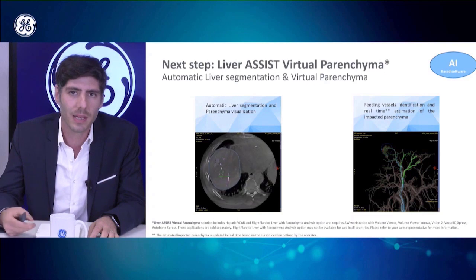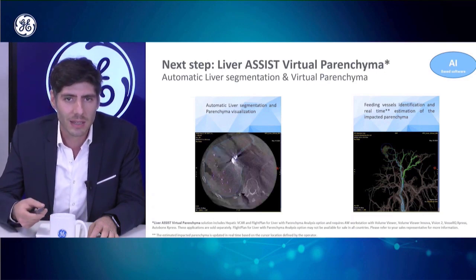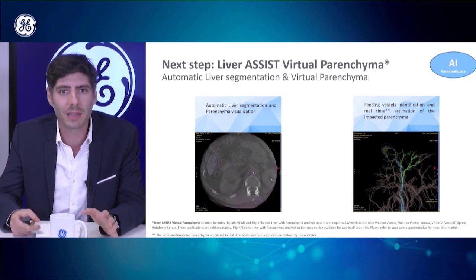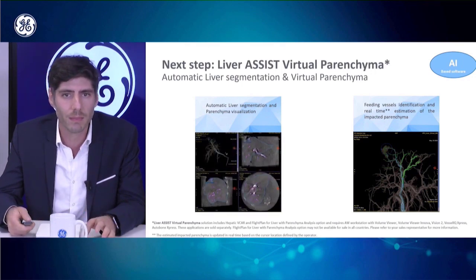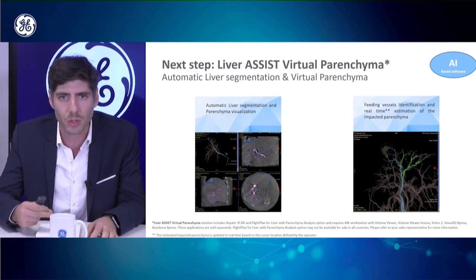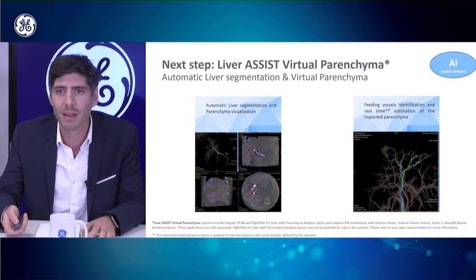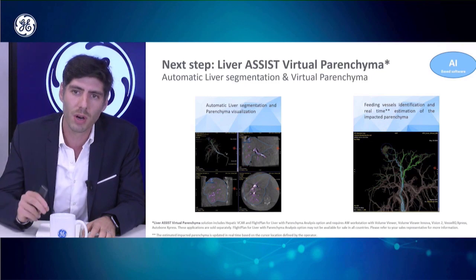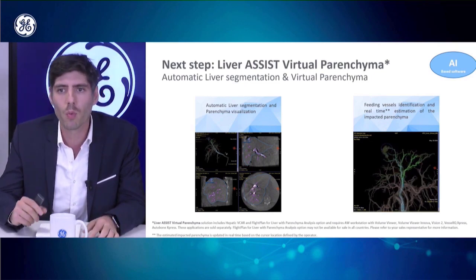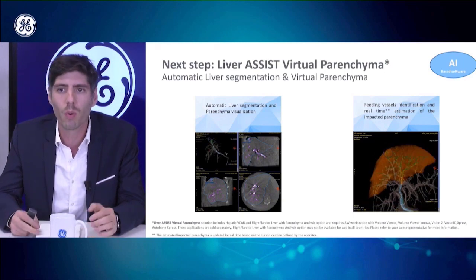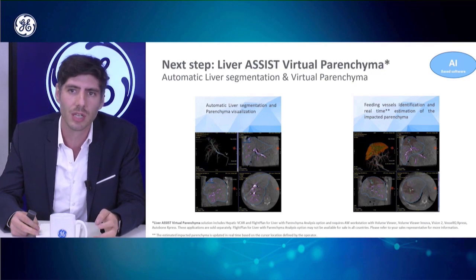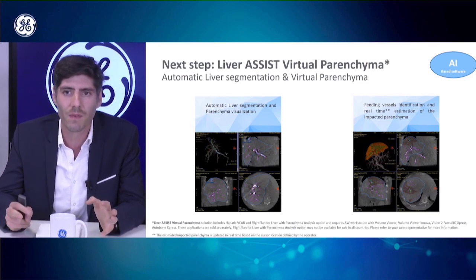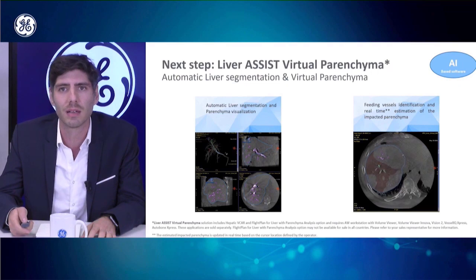The next step is how to use Liver Assist Virtual Parenchyma. In a CBCT acquisition you can see the segmentation of the liver volume in blue, which is an AI-based algorithm that very rapidly provides the liver volume with good confidence. You can then navigate on all extracted branches to see which branch feeds the tumor, and depending on where you select your injection point, you can identify what parenchyma will be impacted — giving you a virtual estimation of the treated liver parenchyma.